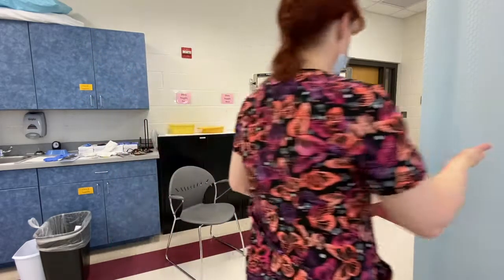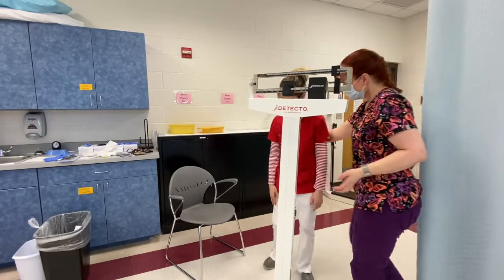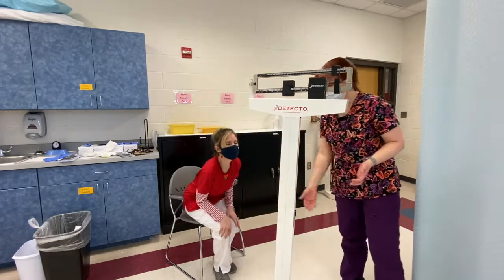I adjust until my indicator in the window is not touching the top or the bottom. At this point I'm going to have her step off the scale. If you want to return to your seat — wonderful.